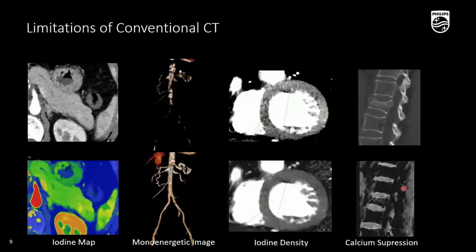The fracture in the spine, we can apply what's known as a calcium suppression, which is essentially removing the calcium signal from the image so that we can see everything else. And in this case, what we're mainly seeing is water and fat, and the water is now hyperdense. So everything with water, and you can see that as well with the discs, the vertebral discs, and also in this area with the fracture in this vertebra, you see signal as well indicating the edema that's come in. So this would then suggest that this is a fresh fracture and should be operated on.